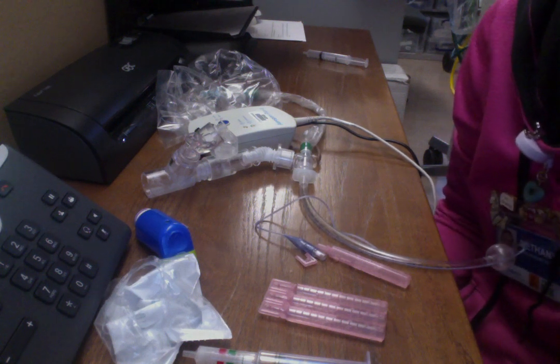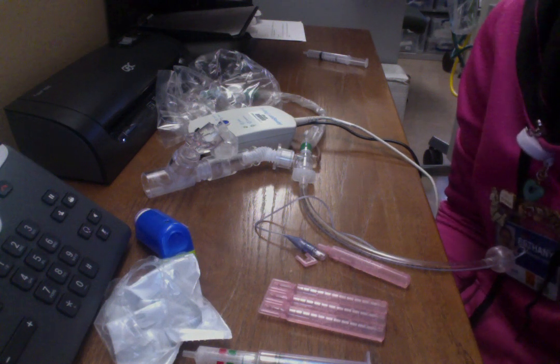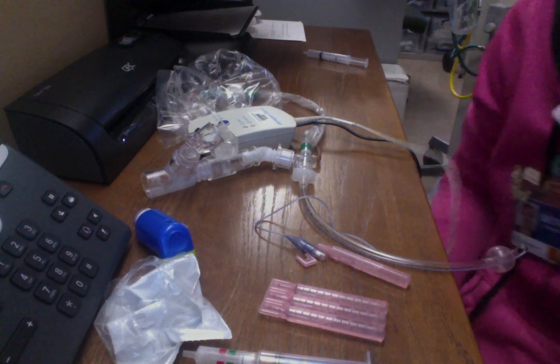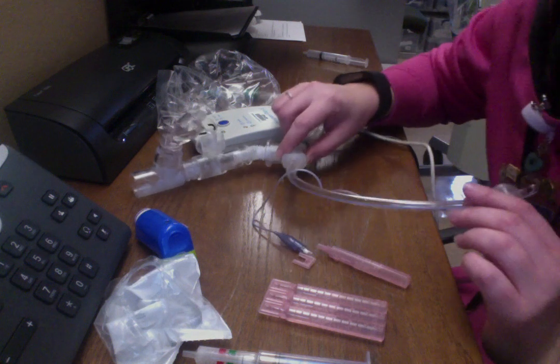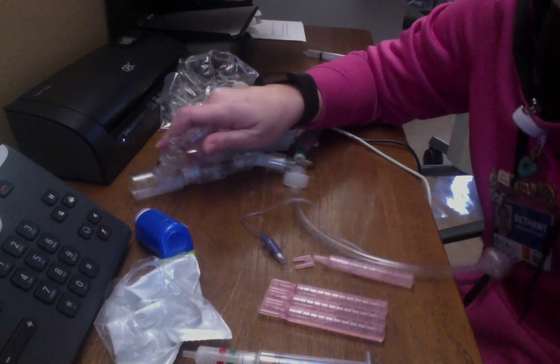I'm going to go over inline cuff monitoring, inline suction, aerosol, and MDI. I have my ET tube here, my suction, and then all of my medication adapters over here.